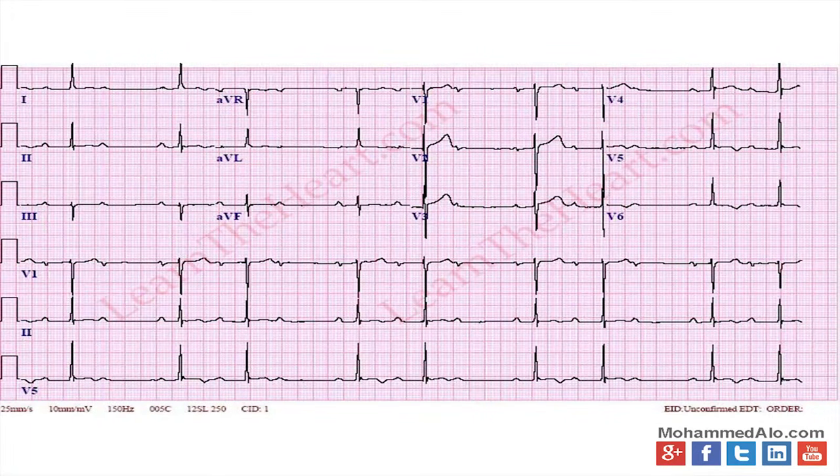Here's another rhythm. You got PQRS, PPQRS, PQRS, PPQRS. So you also got group beating. You got basically two beats together, two beats together. Is the PR interval getting longer or not? In this case, it looks like it is. You've got the PR interval getting longer. Then there's a P with a non-conducted beat. So you're dropping beats after an atrial contraction. It looks like another Mobitz type 1. If the PR interval was constant, then you'd call it type 2.